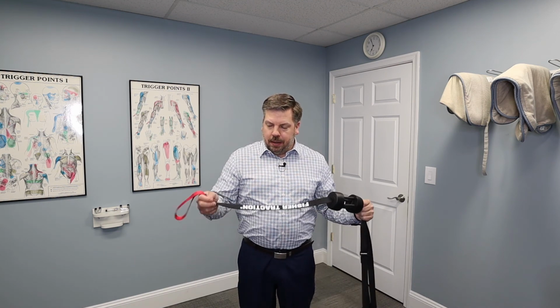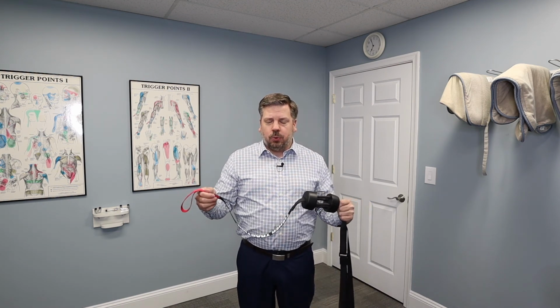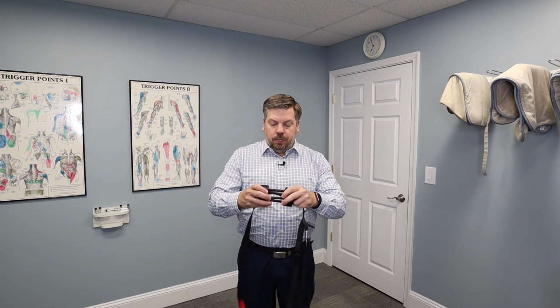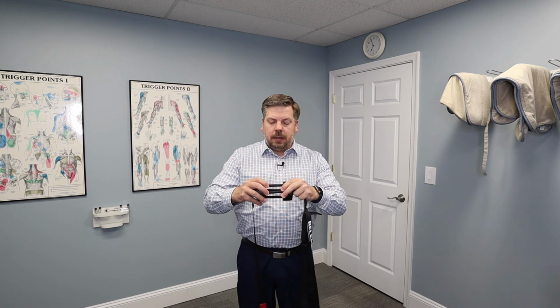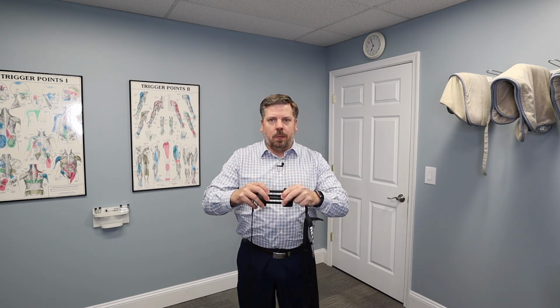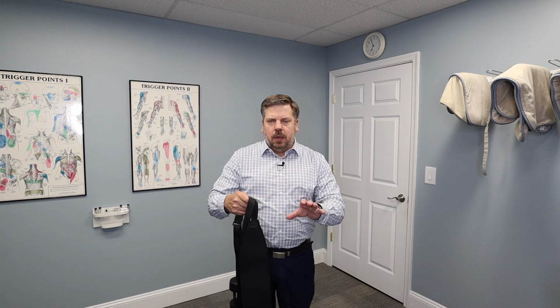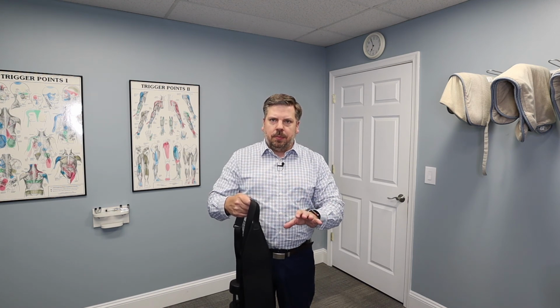There's a strap here with the red handle that goes around the actual door handle, and that gets secured into the door. Then there's this portion of the unit which is basically going to create the traction in your lower back. And then we have this portion here, which wraps around your lower back and pulls on your pelvis as we're getting the traction there. So I'm going to show you how we would set it up in the door, and then I'll show you what it looks like once it's applied.